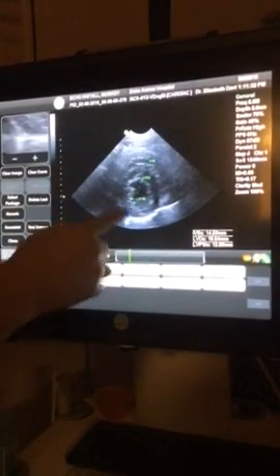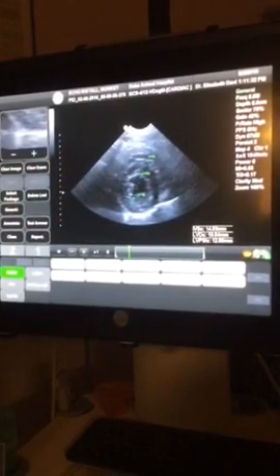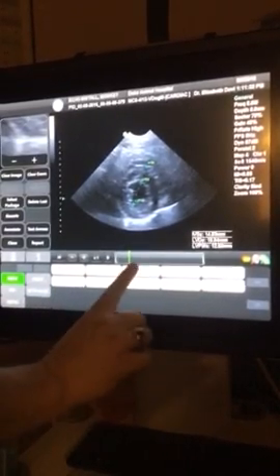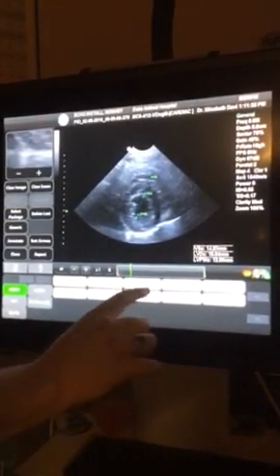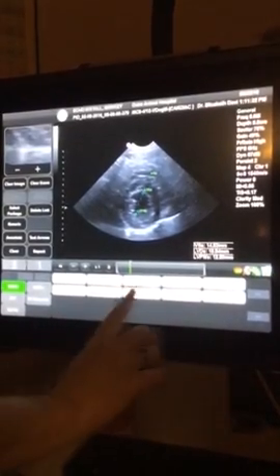You want your line consistent. You don't want a lightning bolt shape in there, so you just want your line kind of consistent. And we'll use number 1 to lock all that in. Without this prior set of measurements, it would have just said 1, 1, and 1. But if you notice, we have a set of 4 here, and that's what you want. You don't want an odd number like a 1, a 2, a 3, a 2, a 1, a 4. Okay, you want all your measurements consistent.